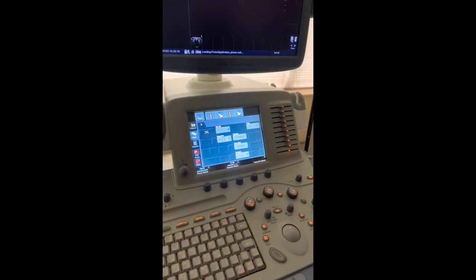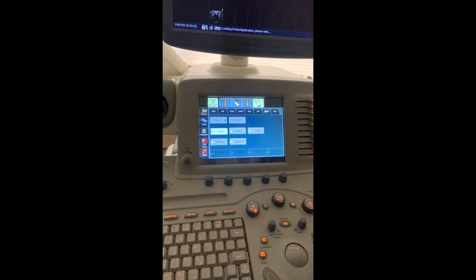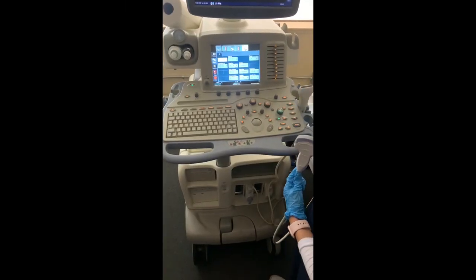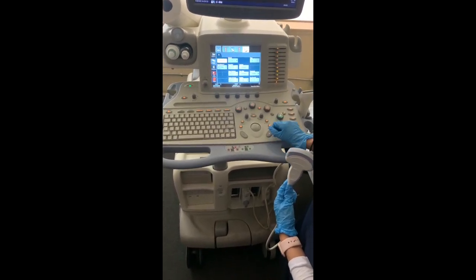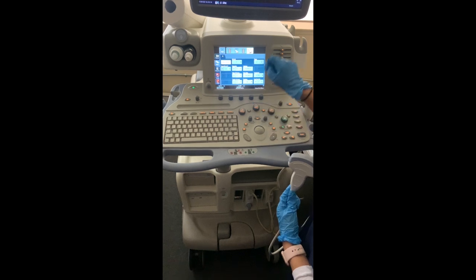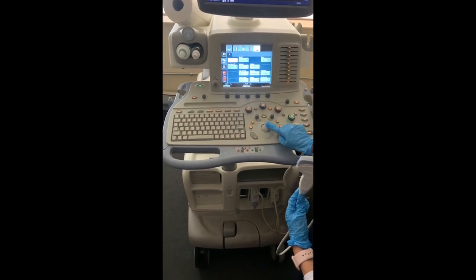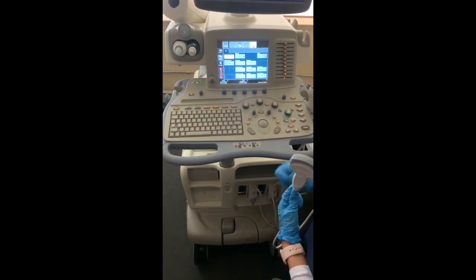Since we will be doing a brief vascular protocol of the aorta, select the correct presets on the machine. Taking a quick look at the essential knobs: this here is your gain — it will allow you to increase or decrease your overall brightness. Next, you have the pulse wave button which will allow velocity to be measured in vessels. This large trackball is your mouse pad, and lastly, the comment button will allow you to annotate using the keyboard.